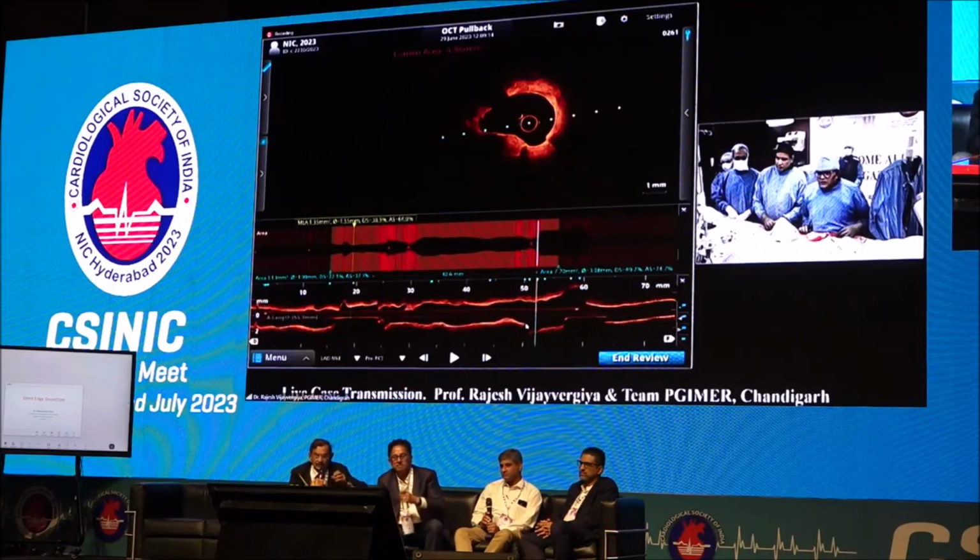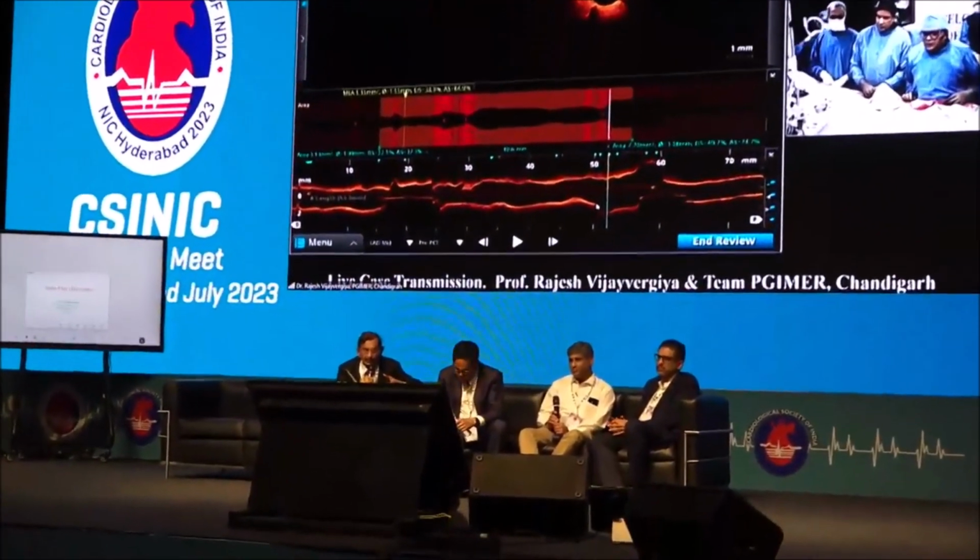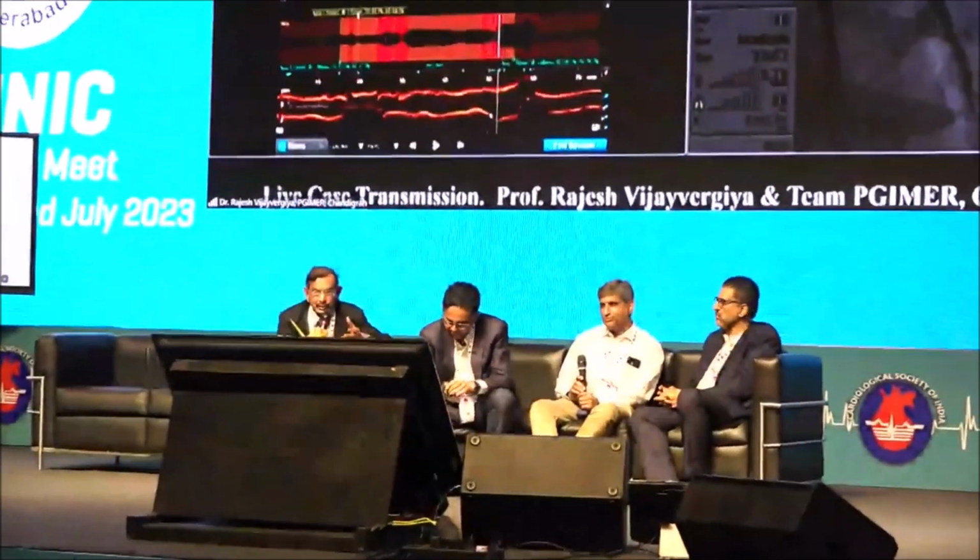Rajesh, I believe that is a little better. We have to prepare the ostium also with the cutting balloon prior to the provisional stenting of the LAD. Otherwise, great difficulty will arise later. Right. We do have a 360 arc of calcification across the LAD. Any comment about other than cutting balloon, rotablation? There were some calcium specks in the mid and proximal LAD, so you can have a look again carefully and then take a decision.